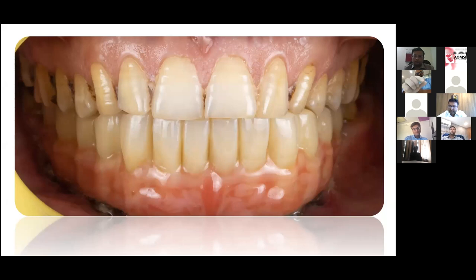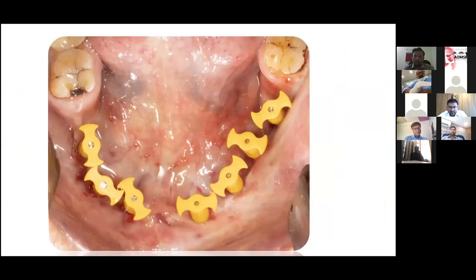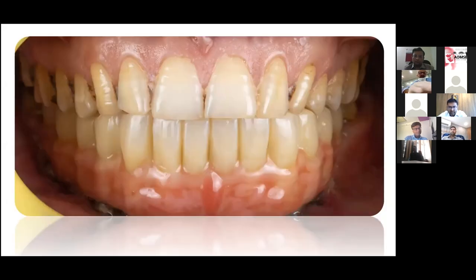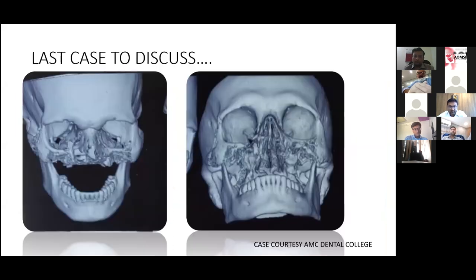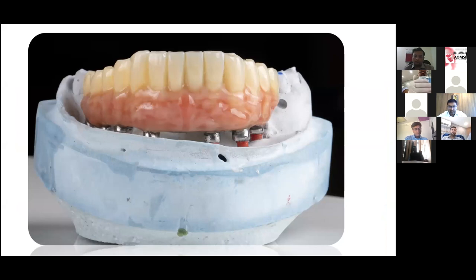Yes, sir. If the abutment is in contact with the soft tissue, then you'll always find the soft tissue is going to rub along with your implant abutment. And there will always be a problem. And I've seen the seepage of the infection also. So my point was, whatever we do, if we keep a sanitary space, that is the best thing we can do.